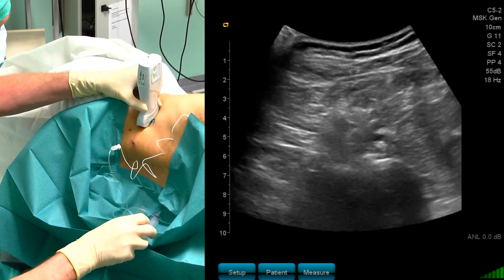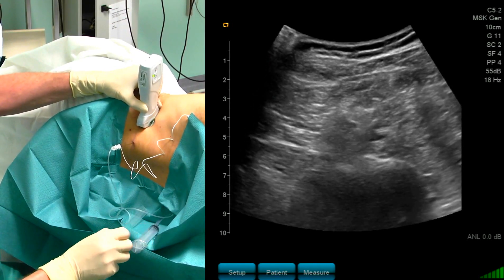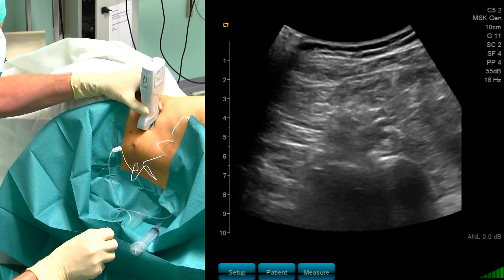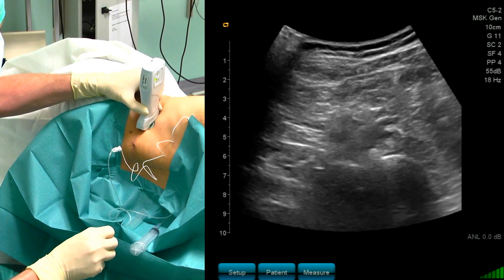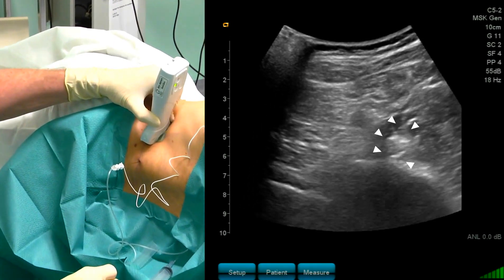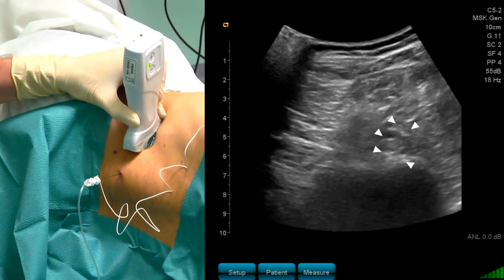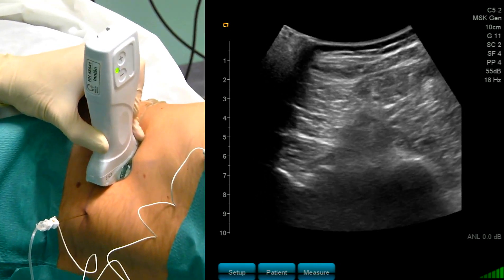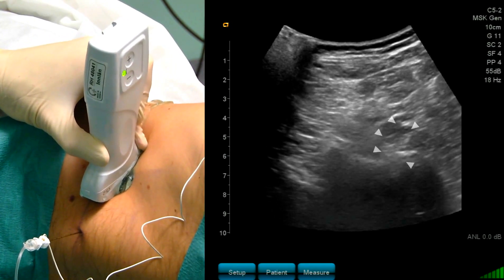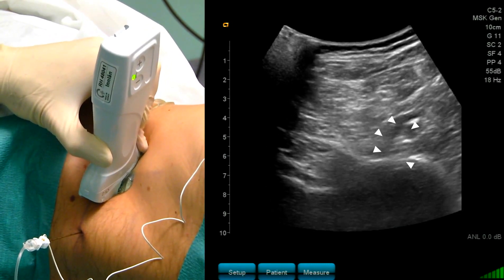Now you can see that the nerve is surrounded by local anesthetics. I perform a scan a little bit up and you can see several nerves surrounded by local anesthetic. I scan also caudally, and you can see a nice local anesthetic distribution.